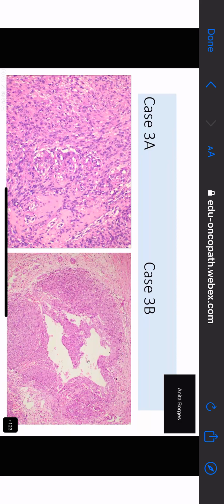And on the left-hand side, you see hyalinization. You see these vessels that are almost showing you what you see in glioblastoma. That's endothelial conglomerates, glomeruloid microvascular proliferation. Exactly. Microvascular proliferation is being seen. And you see these cells here, the nuclei looking round. Why? Because it's a fascicle that has been cut at right angles.